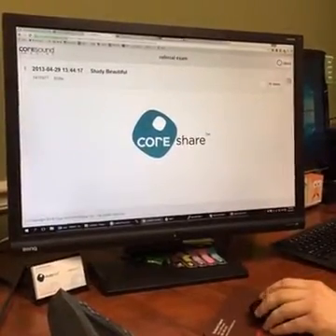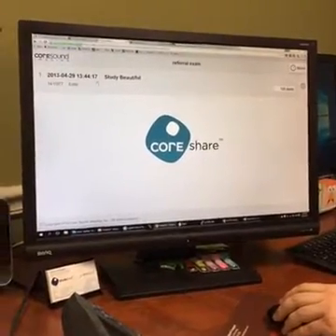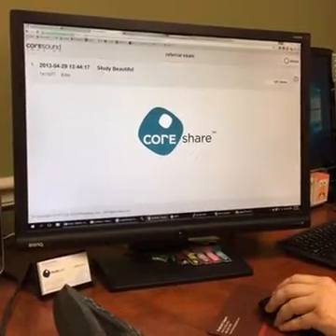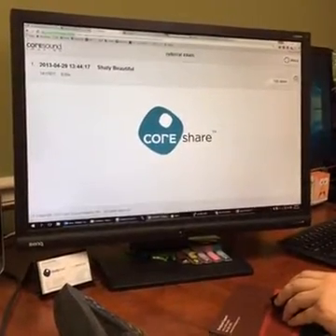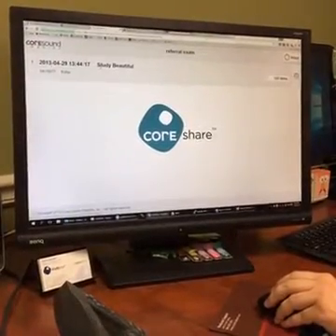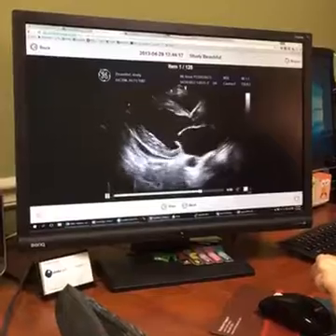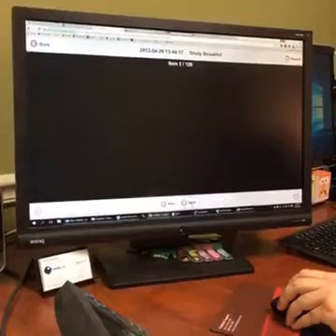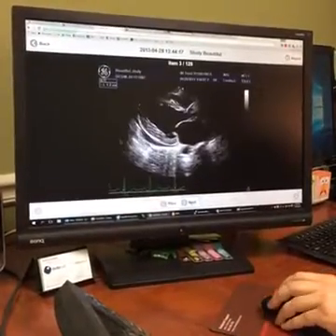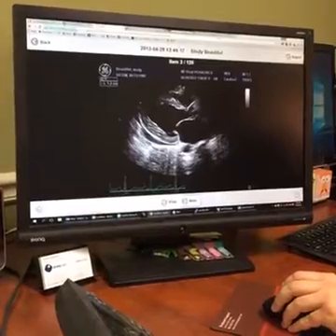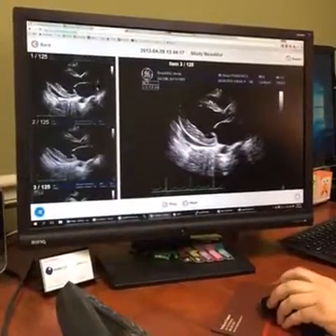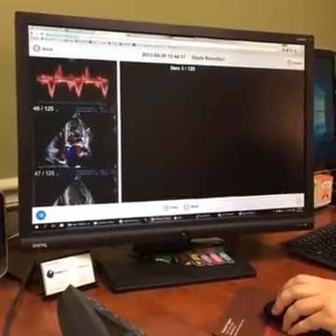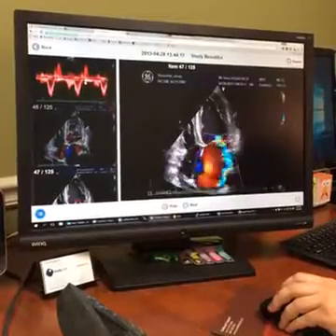Once you do that, you will be presented with a list of either the study or studies that you have shared with this client. You'll see there's the one exam here — there are 125 items. If I just click anywhere on here now, it's going to open up the images for that particular exam. This is nice because you have play controls here if you wanted to cycle through the images. There is also, over here on the bottom left, a thumbnail browser, so if you wanted a quick overview of all the images in the exam, you could cycle through those and directly go to a specific image.